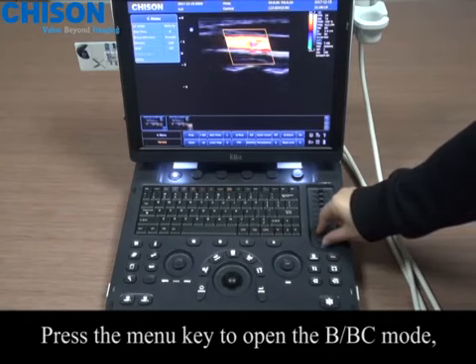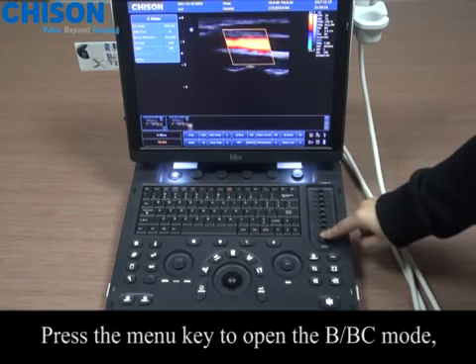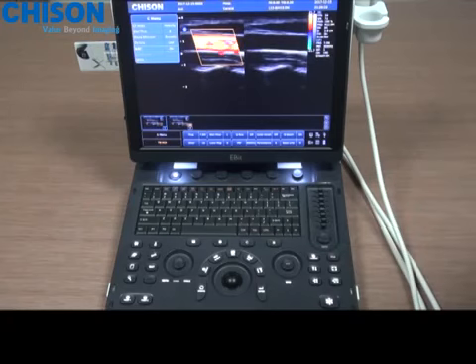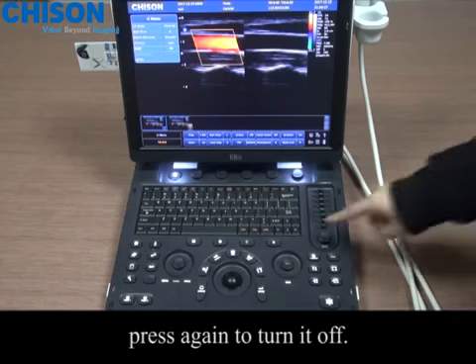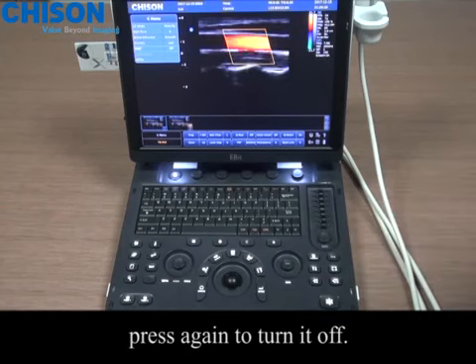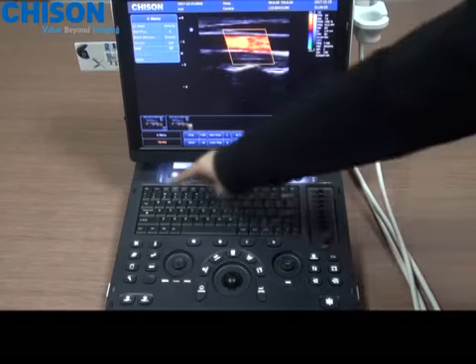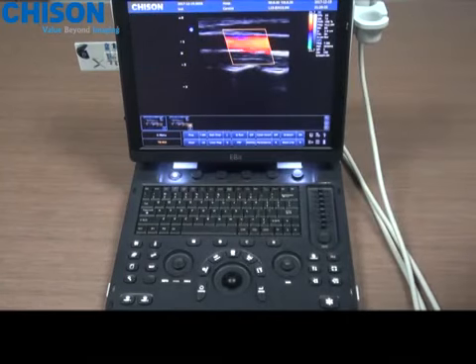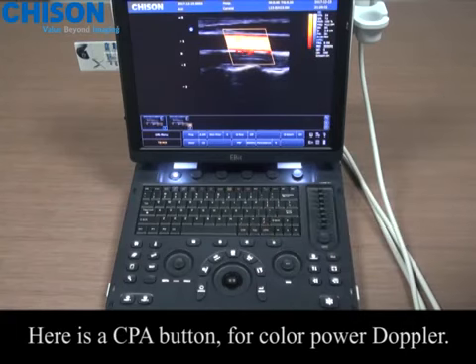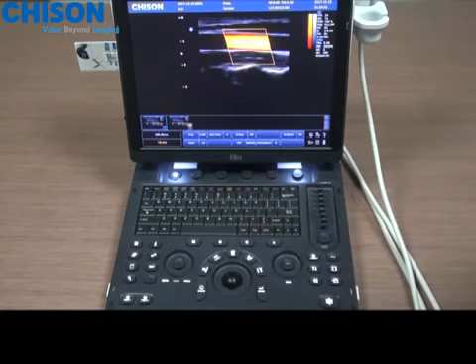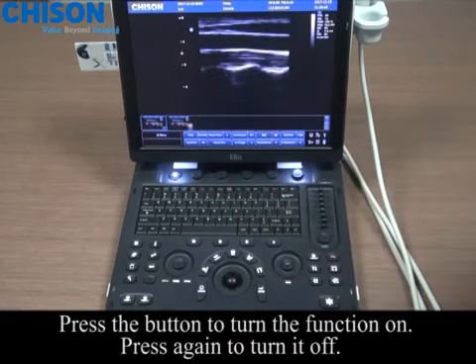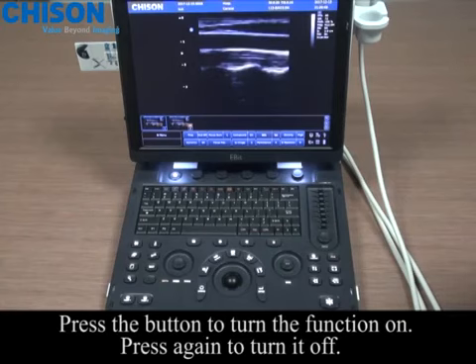Press the menu key to open the B/BC mode. Press again to turn it off. Here is the CPA button for color power Doppler. Press the button to turn the function on. Press again to turn it off.